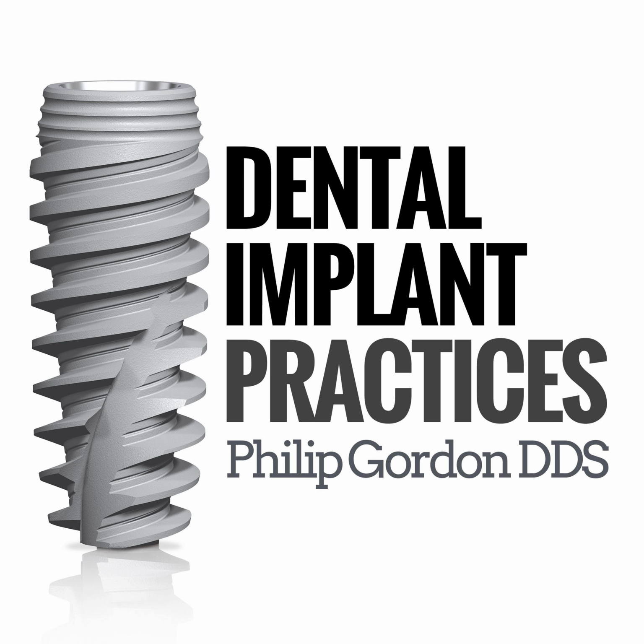We've got all the technology in the office to be able to have the patients come in, accurately plan their implants, print their surgical guides, and then either a provisional restoration or a custom healing abutment when we place the implant. So I think this is the direction that implant dentistry is going. I mean, definitely all of dentistry is going digital.